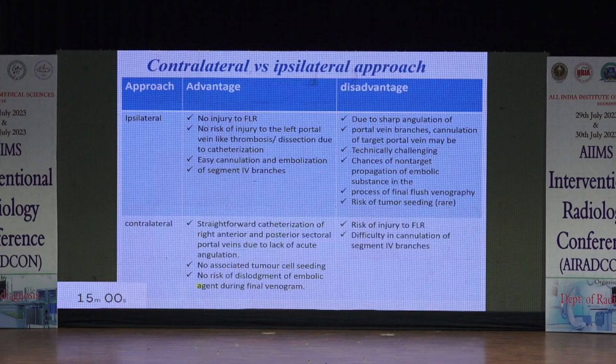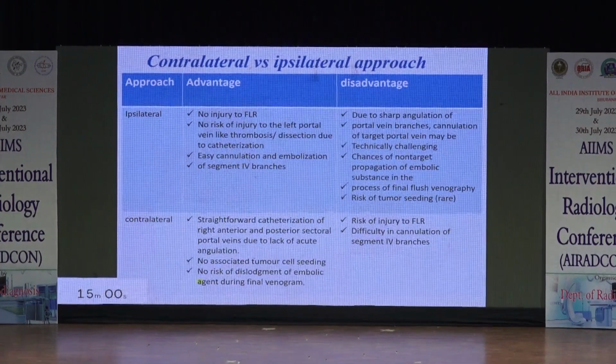The advantage of the contralateral approach is that you can easily manipulate. You come from the opposite side, you can easily go to each segment and do it. And also we can get a very nice angiogram after the procedure. We can keep the catheter and get a nice angiogram. But the problem is, especially if you are using the contralateral approach for glue injection, you should be extremely careful. If the glue sticks to your catheter and is attached to the whole cast, the whole thing will come to the left side and the patient's future surgeries will be jeopardized.